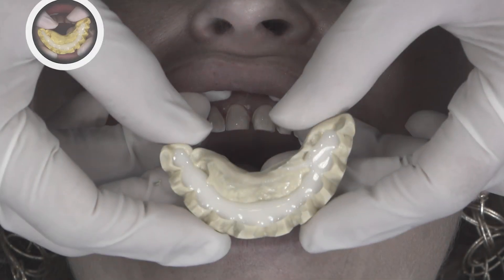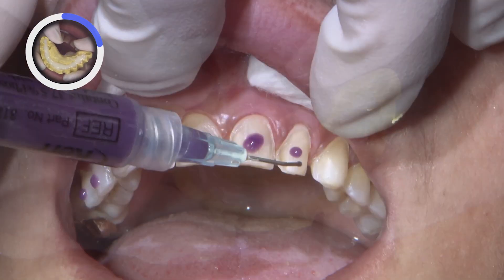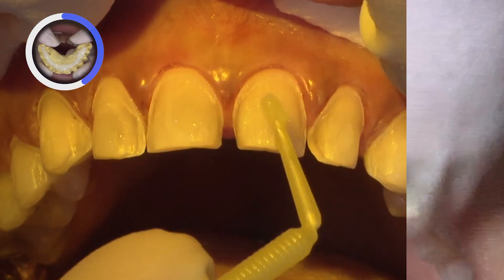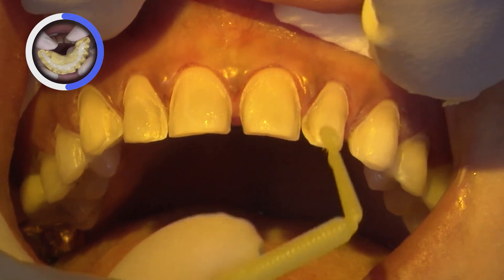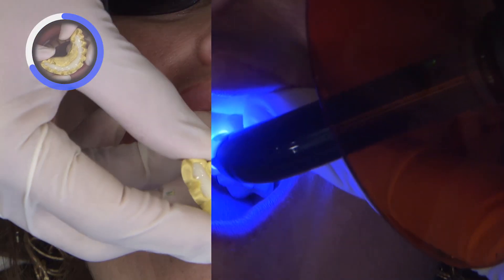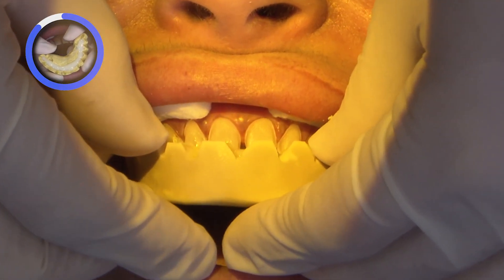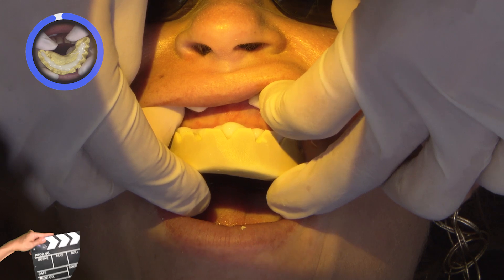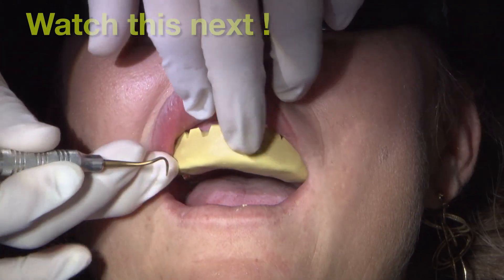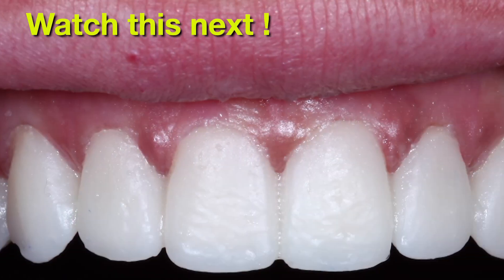For the provisionals, I'll use a shrink wrap technique using the same putty matrix that we used for the initial mock-up. I first spot etch each tooth with Kerr's 37% phosphoric acid followed by a thin coat of 3M Scotch Bond Universal, which will light cure for 10 seconds. Now I'll fill the putty matrix with tough temp bisacryl material and then slowly seat that over the teeth to minimize the inclusion of any air bubbles. With the scalloping created on the putty matrix, it's quite easy to remove the excess from the facial with an explorer or scaler.